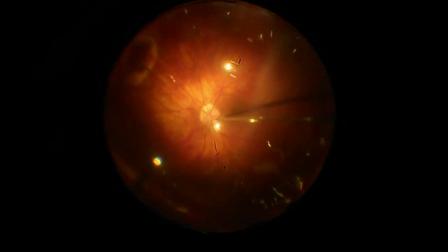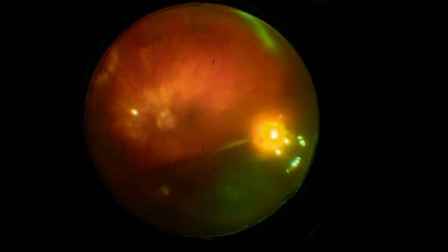Now, we will perform laser treatment around all the lattices that appeared pathological. We will use a sufficiently wide laser beam, not too intense, since these patients generally have fragile retinas. Performing this under indentation helps mark the retina, as sometimes the laser does not properly mark the posterior margins if there is residual fluid. Therefore, having an assistant who can indent can sometimes make this easier.